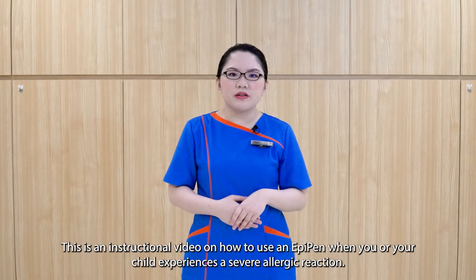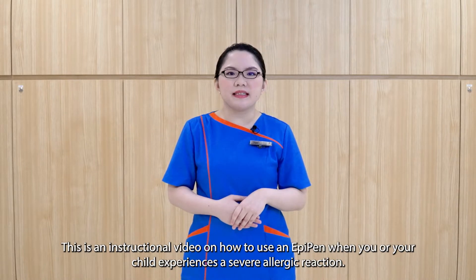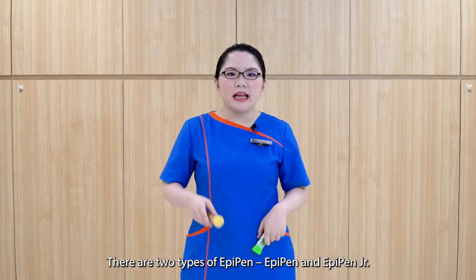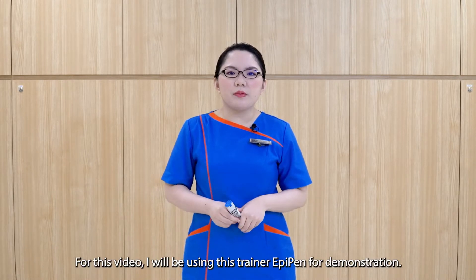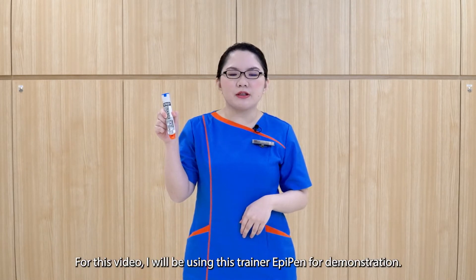This is an instructional video on how to use an EpiPen when you or your child experiences a severe allergic reaction. There are two types of EpiPen: EpiPen and EpiPen Junior. For this video, I'll be using this trainer EpiPen for demonstration.